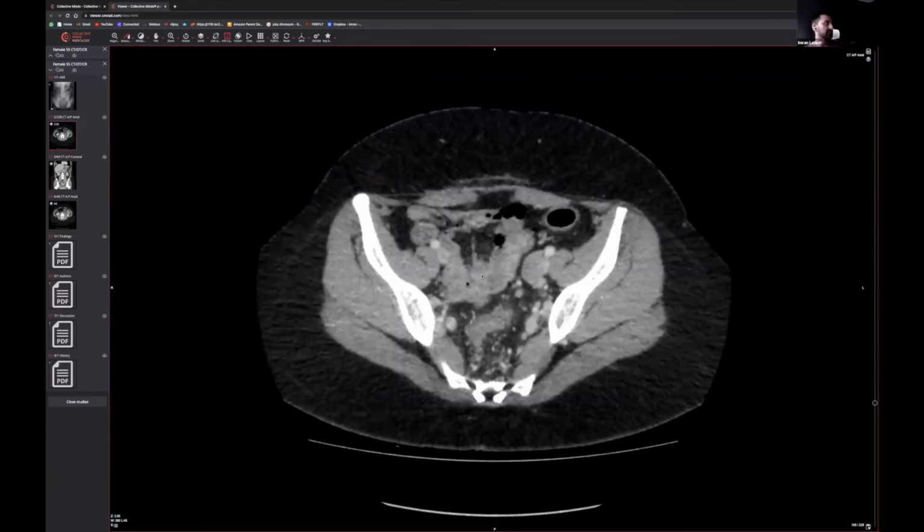So if someone's written edema in a sigmoid pattern, I don't usually use that phrase, because if you're saying that it's only the sigmoid colon that's inflamed, then you may be saying something like colitis focused to the sigmoid colon, or what people may interpret as, is there diverticulitis? Is there diverticular disease? Is that what's going on? This is more uniform inflammation.